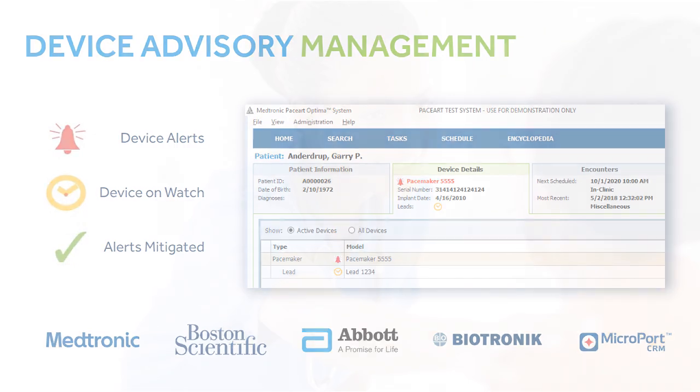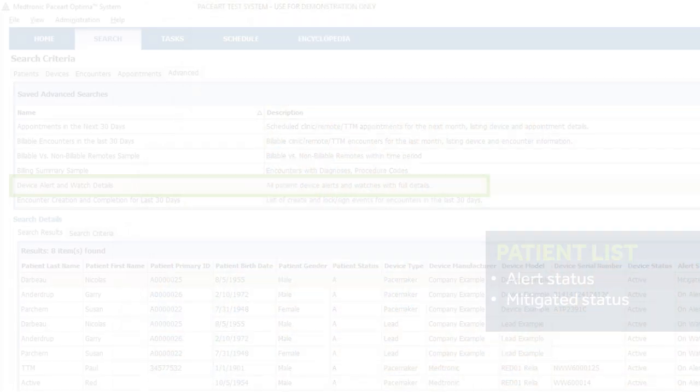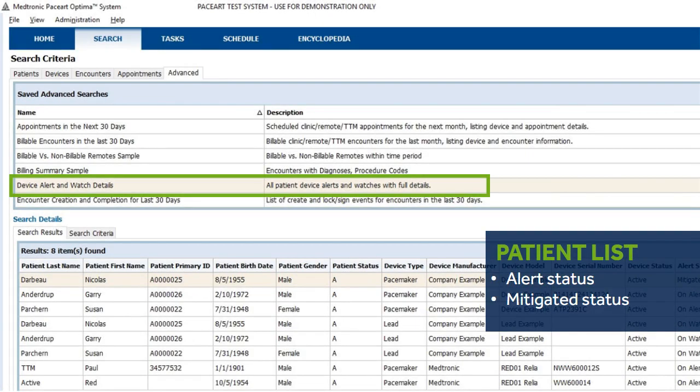giving you the confidence that all affected patients are accounted for. Within moments, PaceArt can generate a complete list of patients affected by the advisory and keep track of those that have been mitigated.